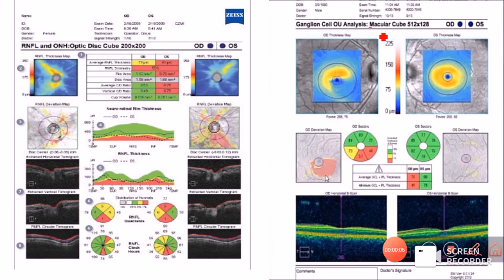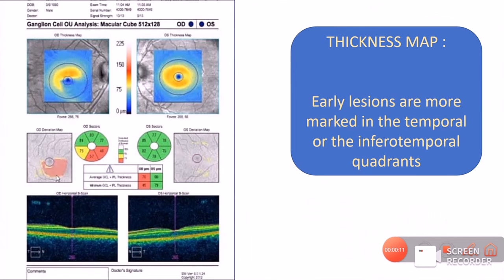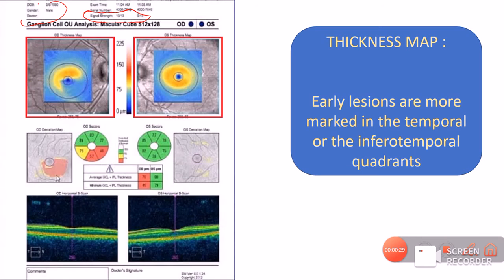Now let us read a printout in which macular analysis is being done. In the macular analysis printout, we first consider patient data, then signal strength — at least more than 5 in Cirrus, more than 15 in Spectralis, and more than 30 in Avanti. Next we consider the thickness maps, which tell us about the thickness of the ganglion cell complex. Red and yellow indicate normal thickness, while blue zones indicate thinning of the ganglion cell complex.